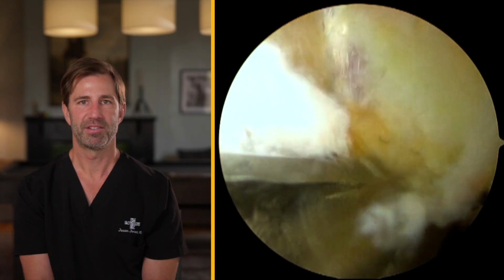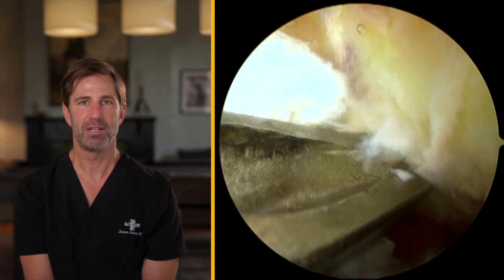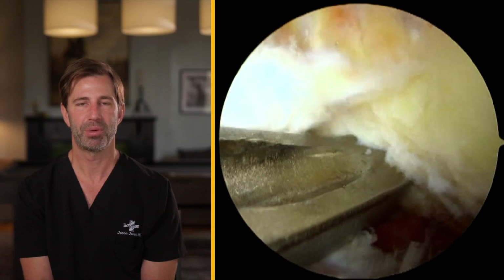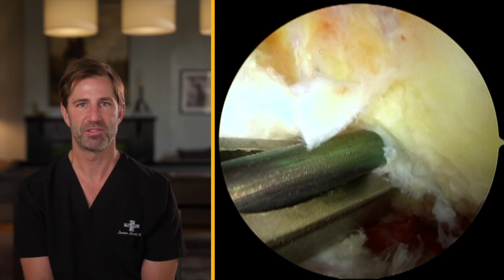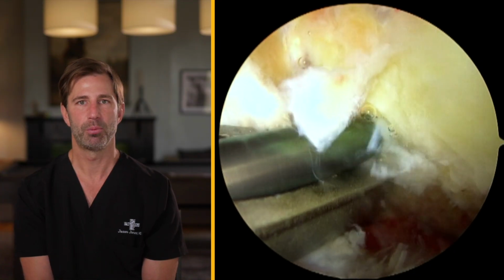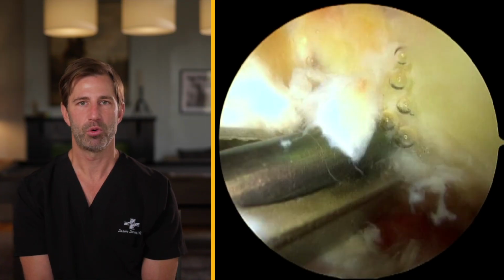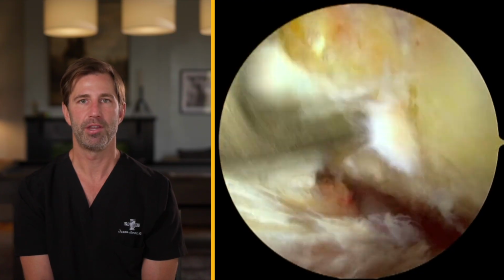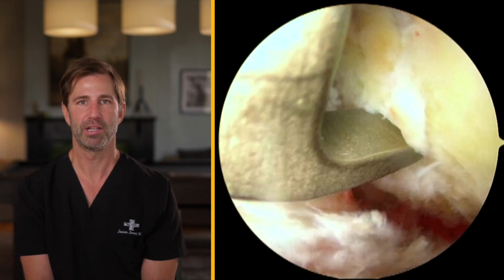From this point, we'll use what's called a medial portal approach. We'll place a flexible pin through this initially marked position and adjust this up and out the lateral cortex of the femur. This will be the origination of the bone tunnel that we'll use to anchor the upper portion of the new ACL ligament into place.